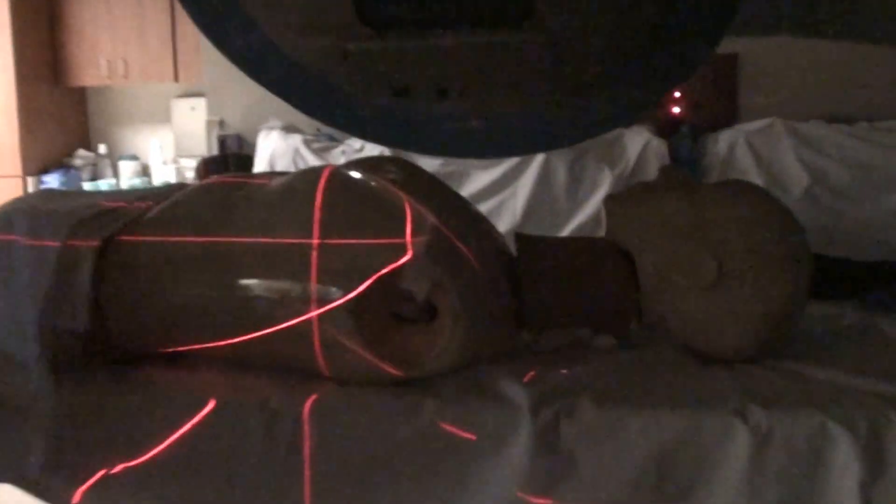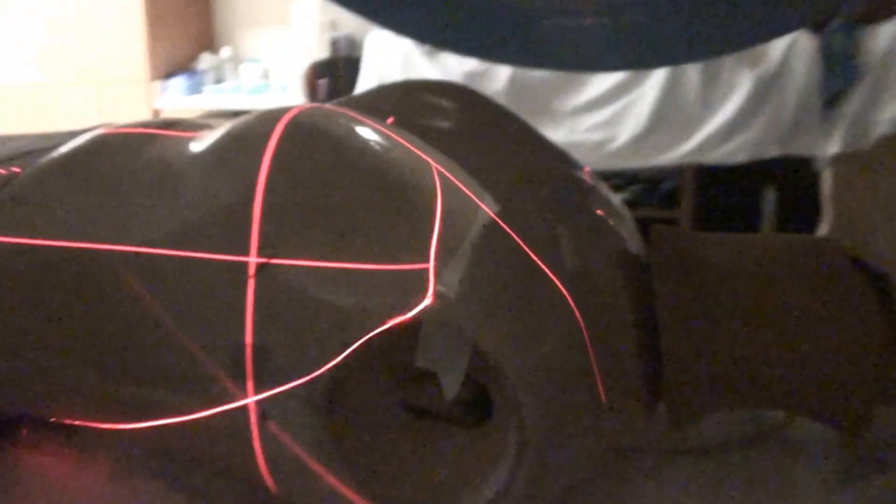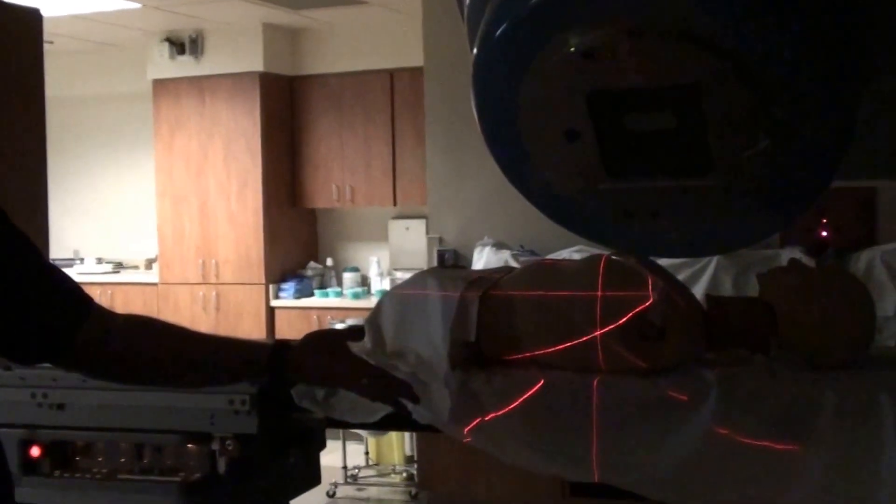About a five degree table kick is all that it took in order to get back to our match line. Now we've got the penumbra on the superior edge of our tangent field matching the supraclavicular field that's already been treated. Now that we're set up, we go ahead and deliver the treatment.